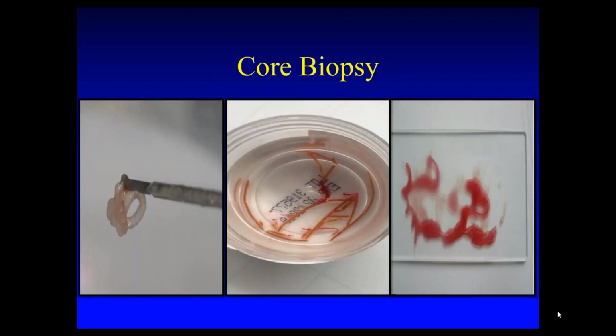So why do we have to do this? Well, by obtaining more tissue when you do a biopsy, it allows you to do more studies as opposed to just telling a patient whether they have cancer or not. It allows you to do possible molecular and genetic studies and be able to tailor each tumor to a particular chemotherapeutic regimen.